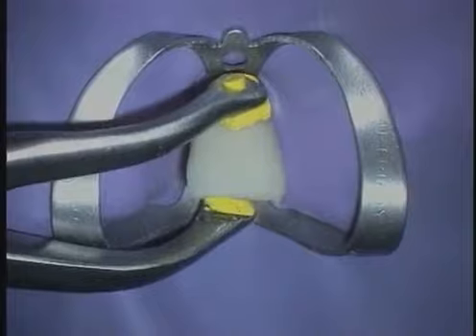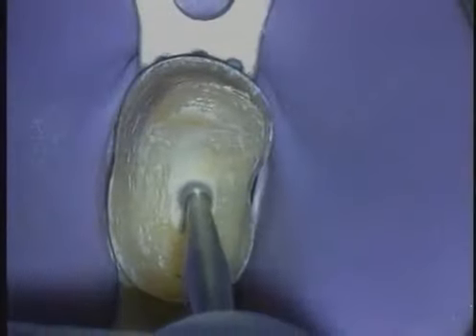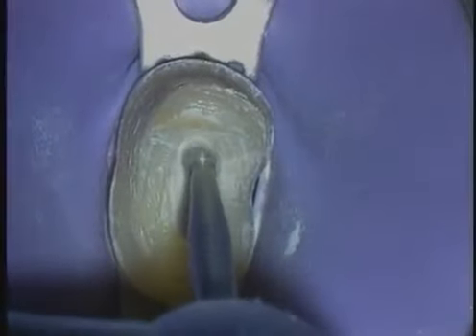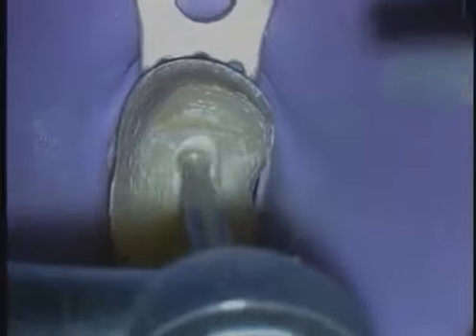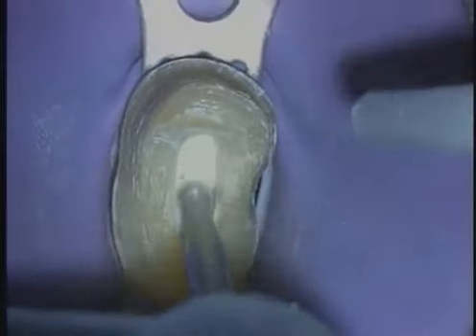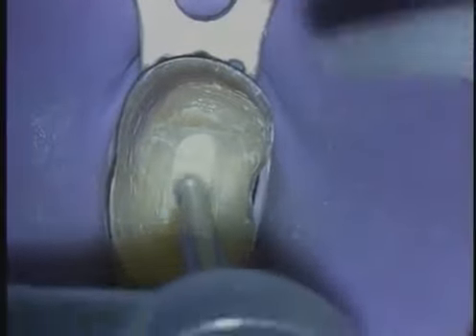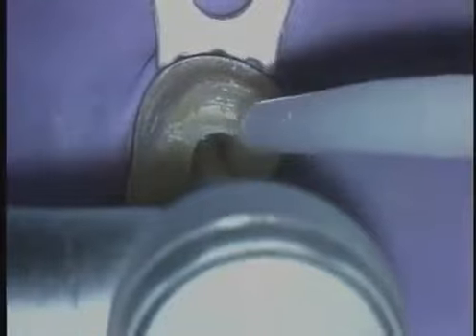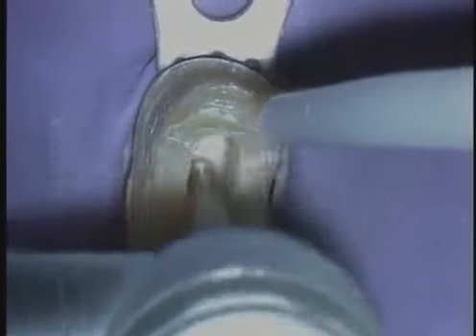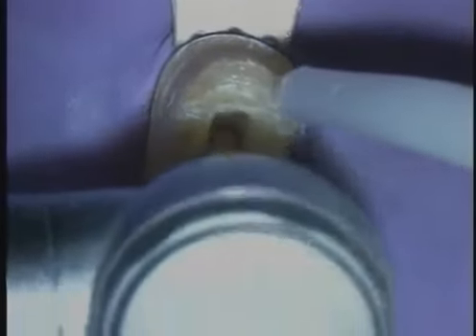Typically, when we're looking for missed canals, if we can get the crown off the tooth, we're going to have better visibility. We'll be able to see the circumferential dimensions of the tooth and how it moves into the gum line. It's helpful to use surgical length burrs. In this case, a surgical length burr kicks the head of the handpiece further off the occlusal table, and that gives us a line of sight along the shaft of the burr. Notice how at all times we can watch the tip of the burr or its bud turning and cutting. This means we're in charge and we have control of the case.